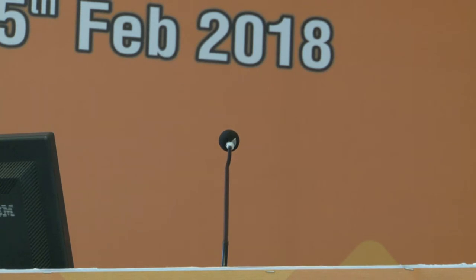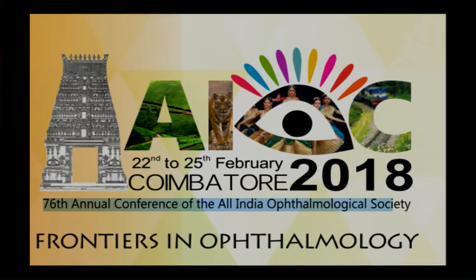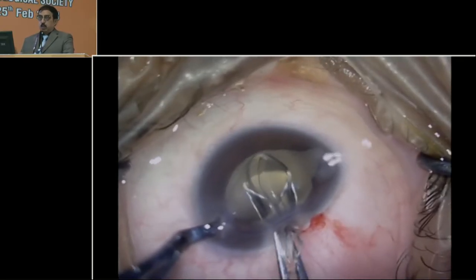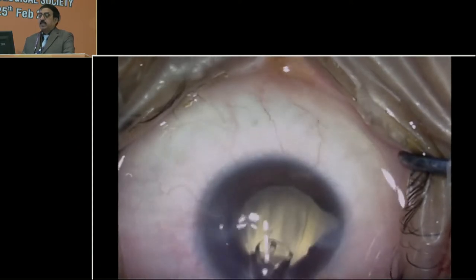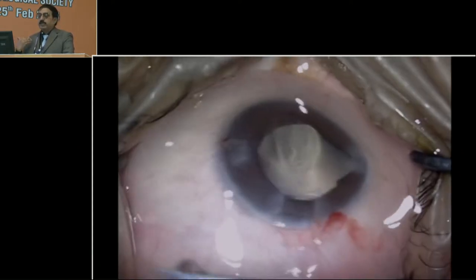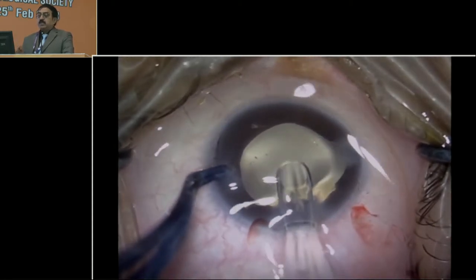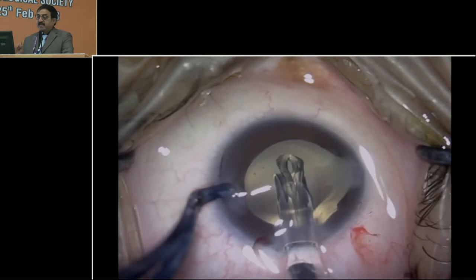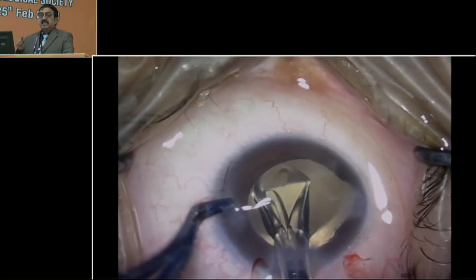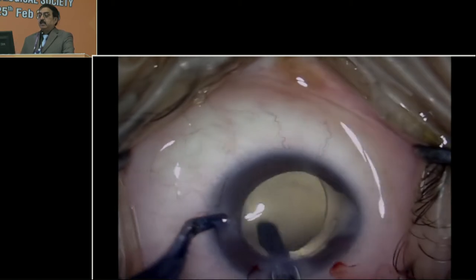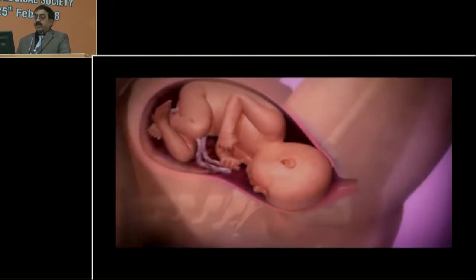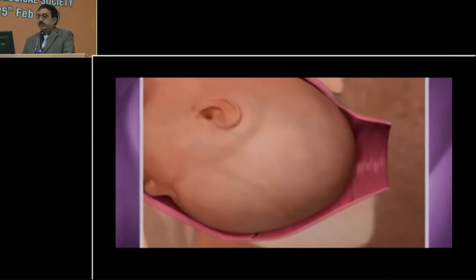I have also used thousands of these NIDAC intraocular lenses and find they really make a difference in the surgical setup. In difficult cases where the IOL is half in, half out and will not advance, the best approach is to remove it, increase the incision size slightly, and put the tip of the injector right into the center. Under visualization, the leading haptic must go inside the bag — remembering these are weak, small bags — and the trailing haptic will also settle in well. When such things happen, let ego not come into the way and do whatever maneuver is best.